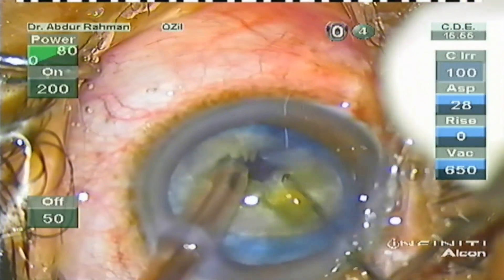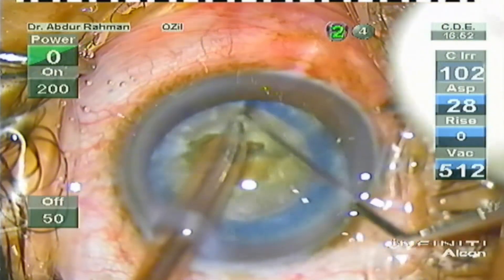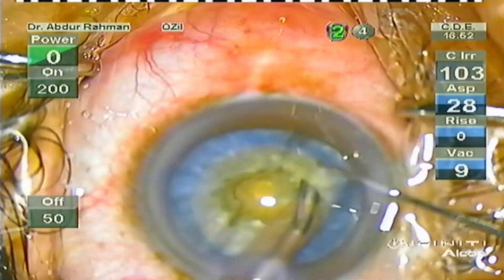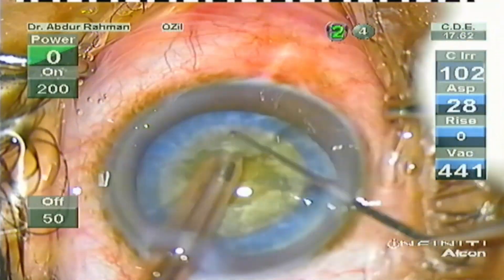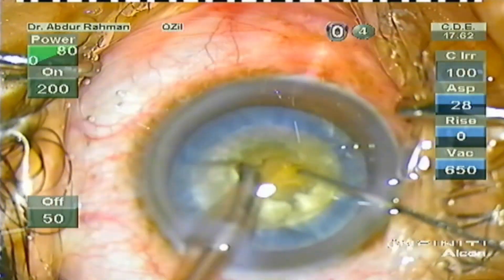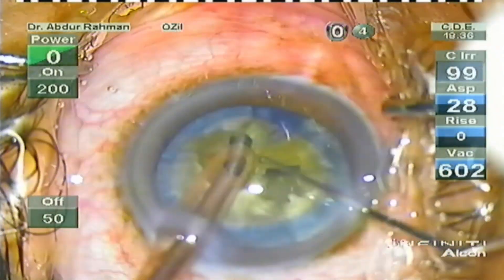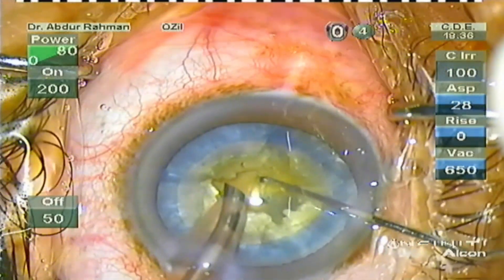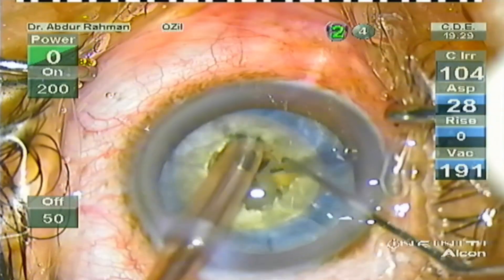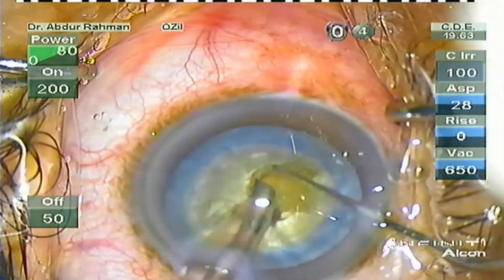Then I'm performing vertical chop. First I bury the phaco handpiece deep into the center of the endonucleus. With high vacuum I hold the nucleus. Then with the Sinskey I perform vertical chop — I lift the phaco handpiece slightly above and towards me, and with the Sinskey I press it down and move it laterally. Thereby I can create a beautiful vertical chop.